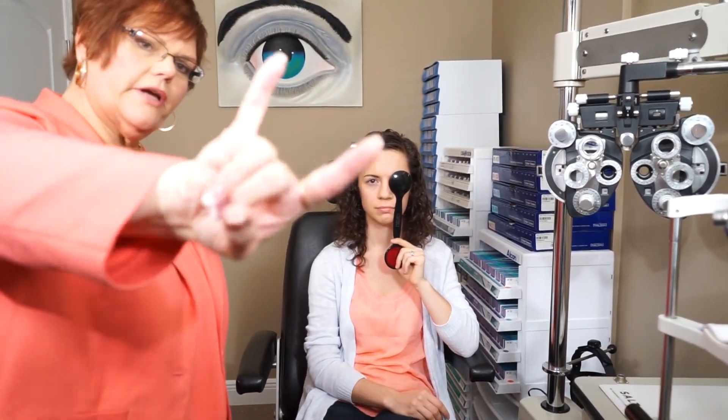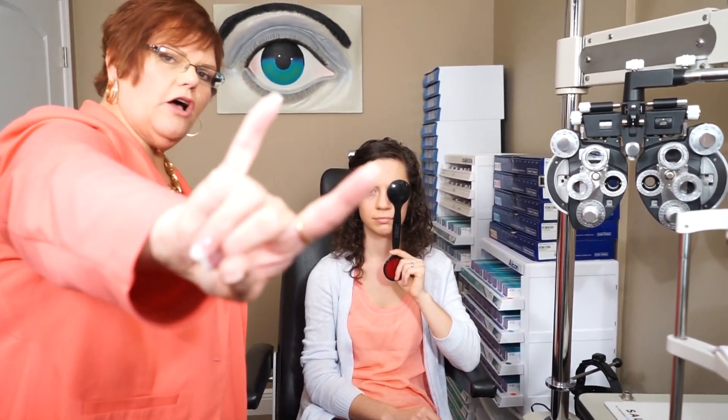If your patient cannot see the big E, you're going to see if they can count fingers. Go to the end of the room and estimate how far away you are — let's say the end of the room is 5 feet. Hold up two fingers with the back of your hand towards the patient and ask, 'How many fingers am I holding up?' If they can count them, it would be documented as count fingers at 5 feet.